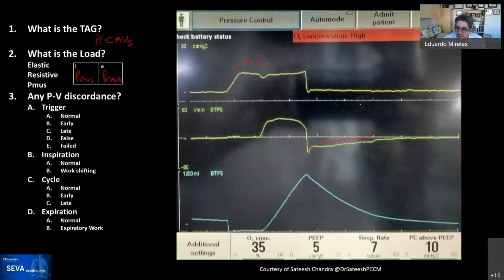Rob? Yeah, and also look at how large the tidal volume is. Generally, that would provide a very high driving pressure for exhalation, but the peak expiratory flow is very low. Right, so that also makes you concerned for a resistive load. Is that what you're saying, Rob? Yeah, either that or it's somehow being distorted by the inspiratory effort spilling over into the expiratory time. Okay. Very good. Thank you, Rob. Any other comments, Rob, here?